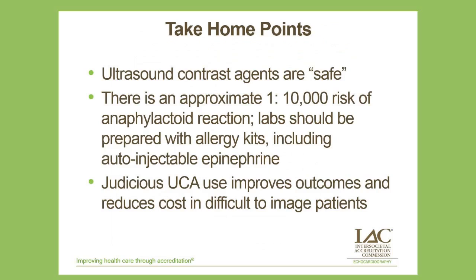So just a few take-home points with respect to safety. I think it's fair to say that ultrasound contrast agents are safe by any reasonable standard. We should be aware that there's an approximate 1 in 10,000 risk of anaphylactoid reaction. We ought to be prepared with allergy kits, including auto-injectable epinephrine. And finally, I think it's pretty clear now that judicious use of ultrasound contrast agent actually can improve outcomes, particularly in difficult-to-image patients in the intensive care unit.